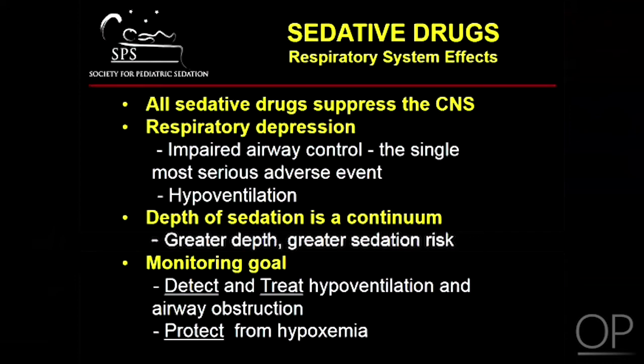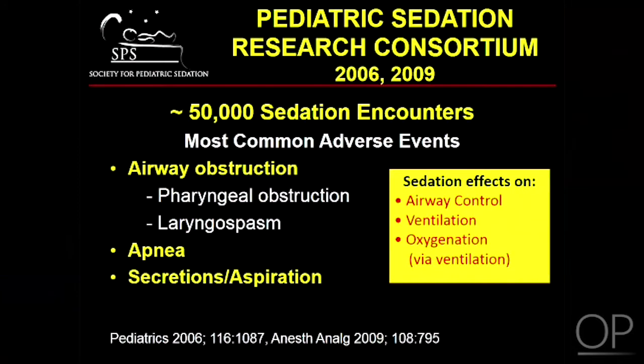These events represent the two most common complications of sedative administration, with impaired airway control representing the single most serious adverse event of these medications. Here it is important to recognize that the depth of sedation is a continuum, with unwanted side effects playing a more prominent role as greater depths of sedation are attained. The detection and early treatment of these events represents the primary goal of appropriate monitoring. By uncovering hypoventilation and/or airway obstruction early, interventions can be initiated to protect the patient from the possibility of subsequent hypoxia. So, what is the prevalence of these events?